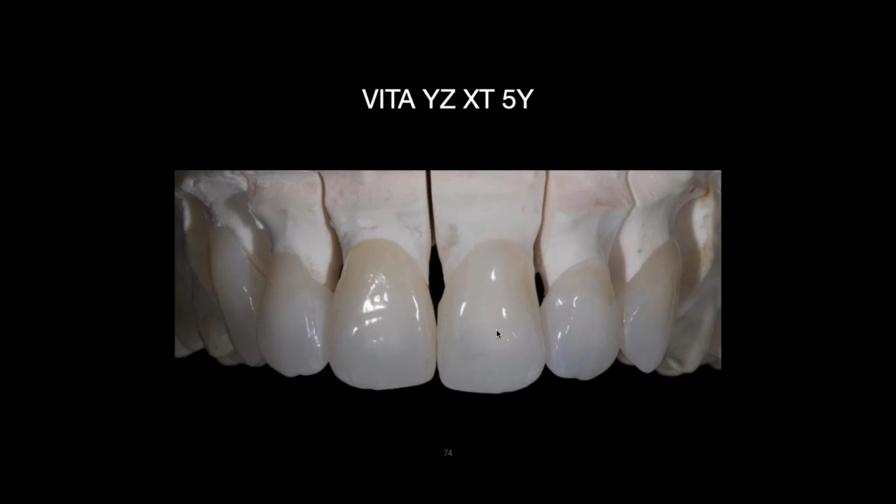And sometimes when you have the 5Y, you can actually get too gray if you're not careful. And so the whole idea is if you're doing a single tooth, you might have to do a couple to make sure that the value is the same. The key to the whole thing is figuring out at a certain thickness, like 1.2 mm maybe, what this thing's going to look like if it's fired properly, and you can have one fired like 20 or 30 degrees higher or lower. Like B&D Dental has a chart.